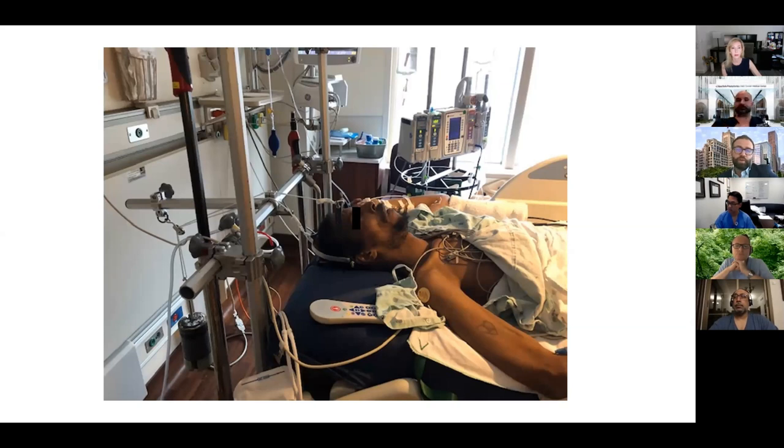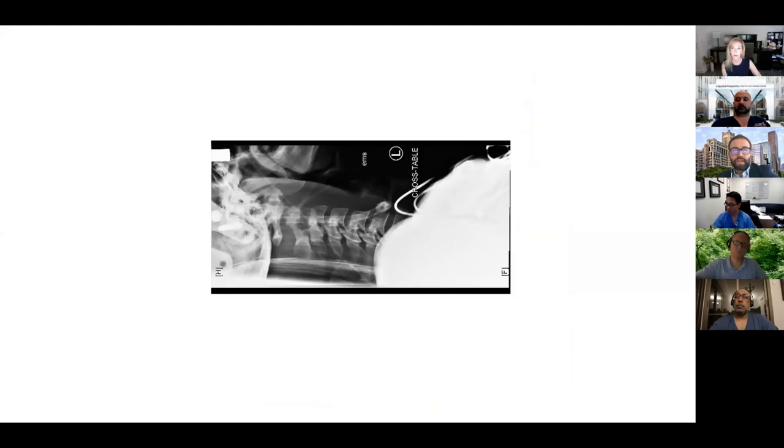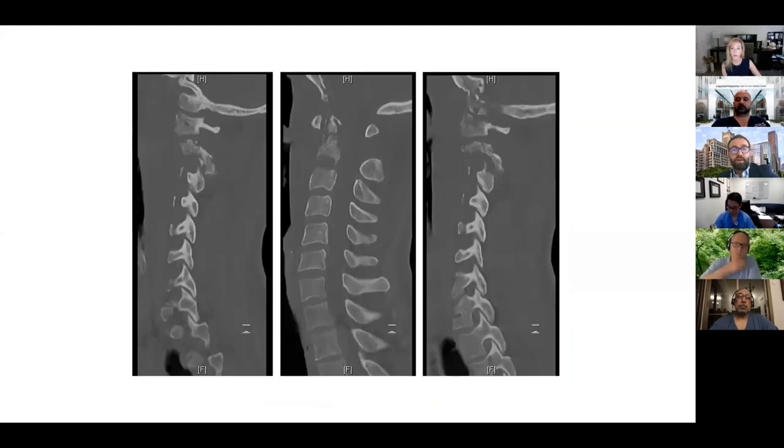you have a deformity, you want to go front back, let's say cervical kyphosis, you can use tongs, because you're going to go from the front. Most of the reduction happens in the front, realigned. Then you can remove the tongs and you put them in a Mayfield. That's fine. But if you want to go from the back to start with, you probably should lock them into a vest. So that's the lateral X-ray. And now that's the CT with the crown halo vest.